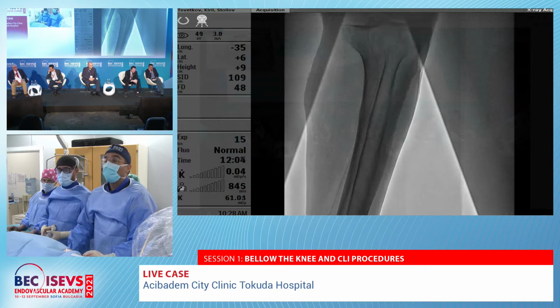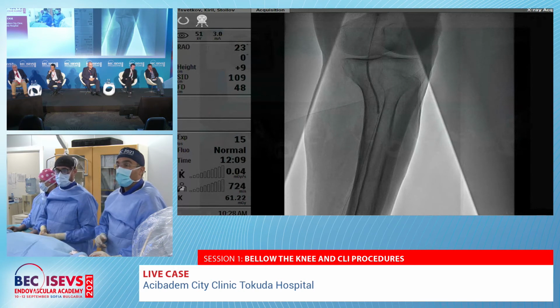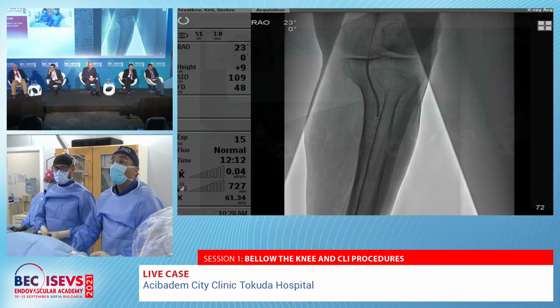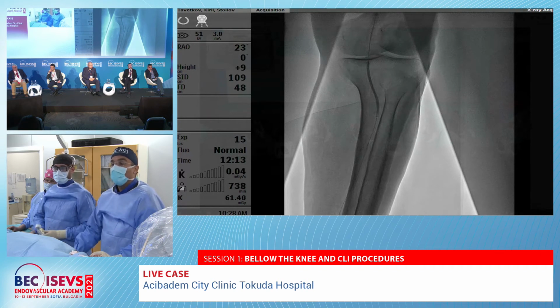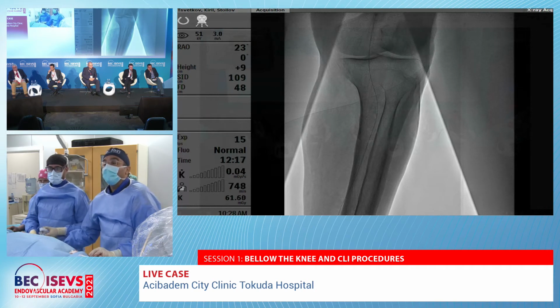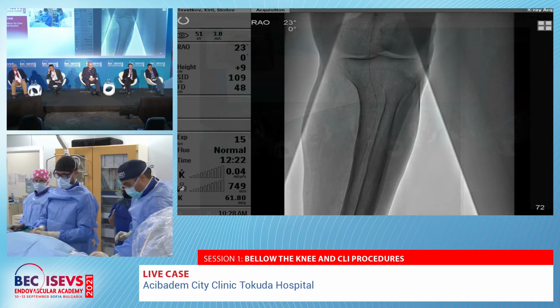If you allow me, I'm Ivo Petrov. I'd like to suggest to inflate a little longer. Short inflation in such a diffuse calcific and atheromatous pathology is not a good idea. So you are working just for pre-dilation. In case you want to have a definitive result, it's better to inflate a little longer, at least 30 seconds.